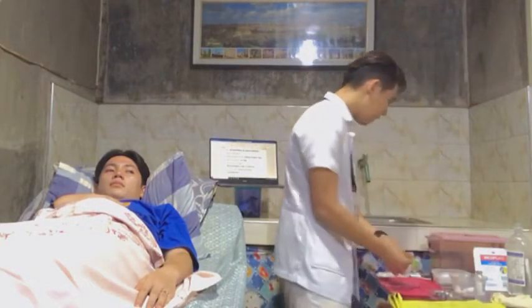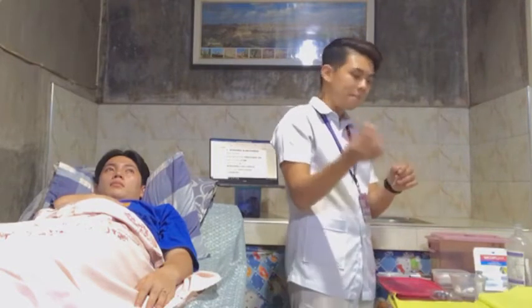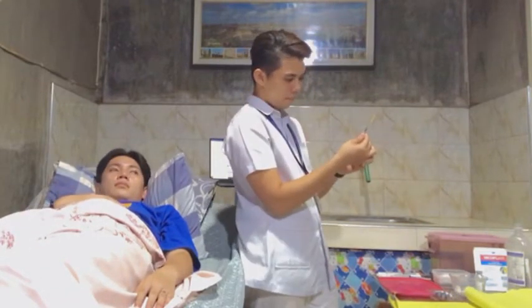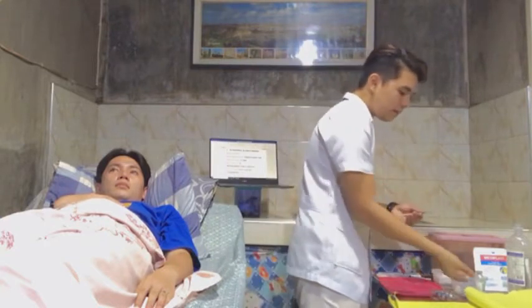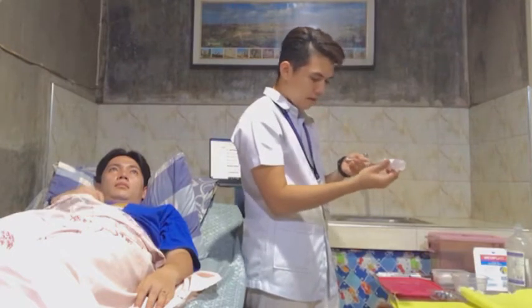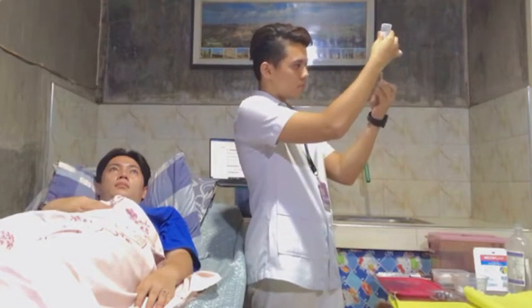So I have here my aspirating needle, and of course, remove the cap, the waste receptacle, and it's 0.75. And then you will be releasing the air into the paracetamol vial, and you can now withdraw the medication.